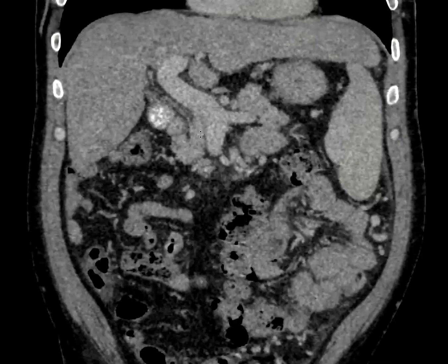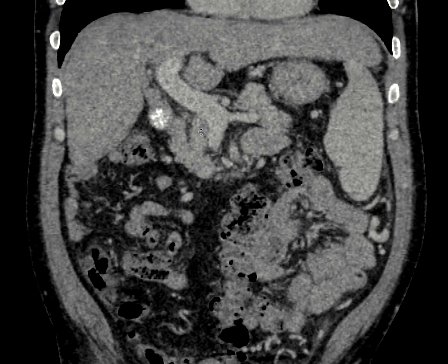The other thing you can look at for portal hypertension is the size of the portal vein, and classically anything greater than 13 millimeters is considered enlarged. In this particular case here, we're about 2 centimeters. Now the 13 millimeter cutoff has been questioned more recently, and 15 millimeters may be a better average portal vein diameter for patients. 20 is really in the upper limits, and so this patient may have some signs of portal hypertension just based off of the distension of the portal vein.